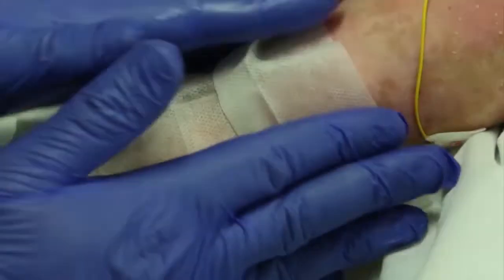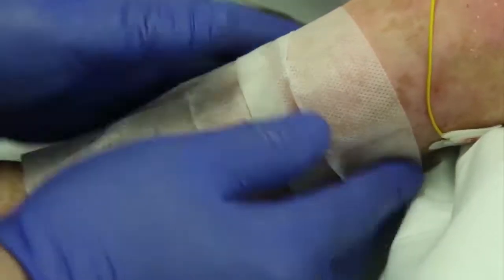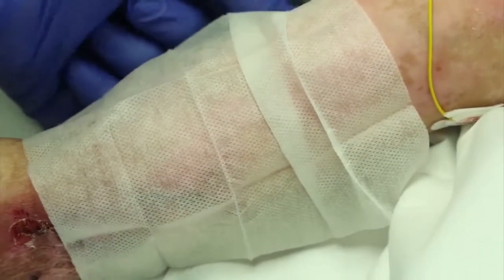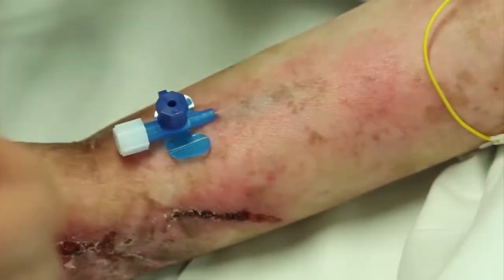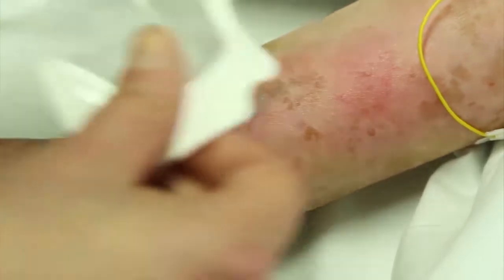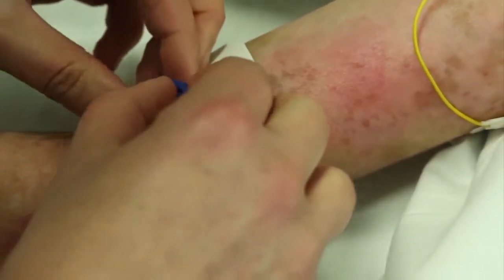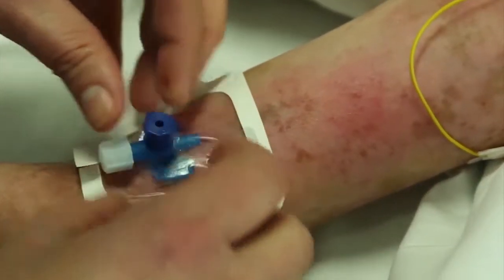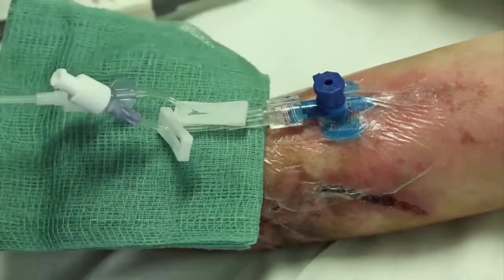Avoid friction when cleaning the skin for intravenous cannulation. Simple direct pressure to occlude the vein is as effective as a tourniquet and also avoids friction. A non-adhesive Mepitel transparent dressing secures the cannula. Hard plastic attachments can easily injure delicate skin, and so they are padded with gauze.